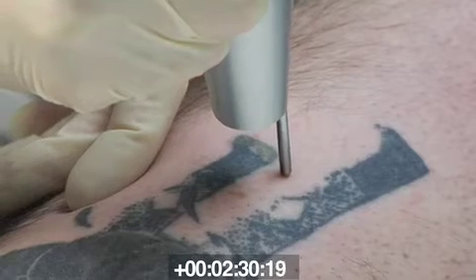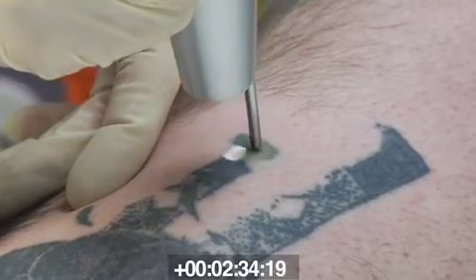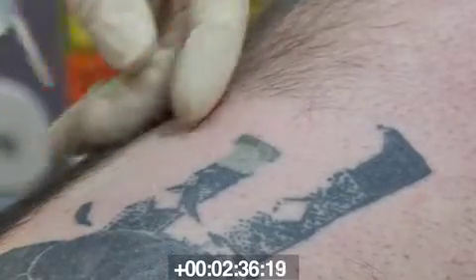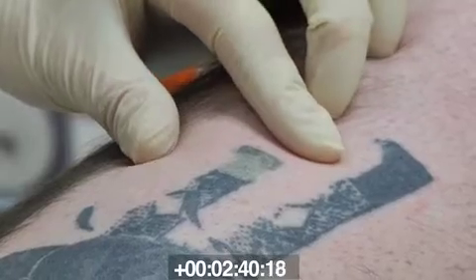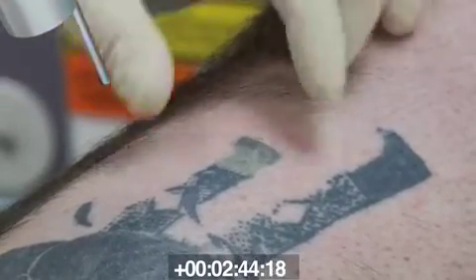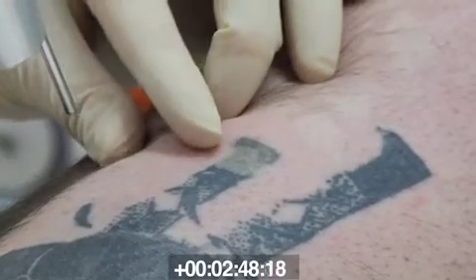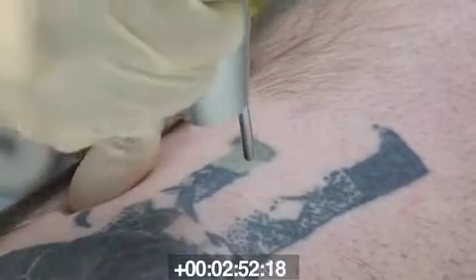I'm going to do an adjacent test spot again. 3, 2, 1. Now that is a very nice fluence. I can feel in the skin the snapping feel when you're really targeting the ink. So my endpoints are a feel in the skin, a crisp white spot to see, and no pinpoint hemorrhages.